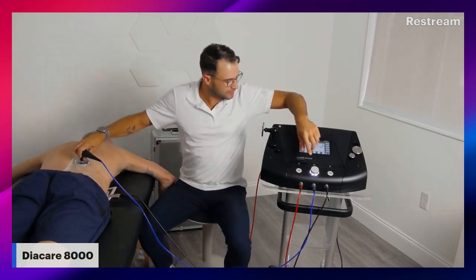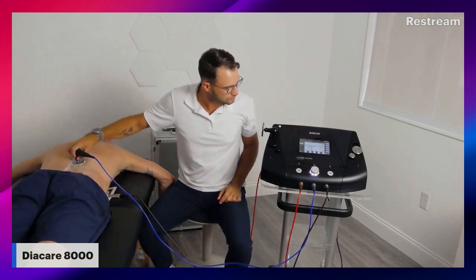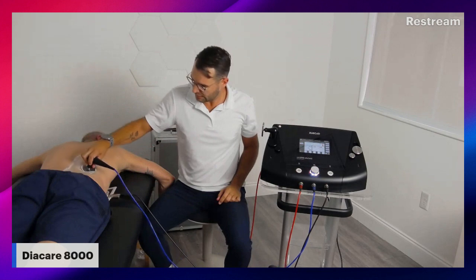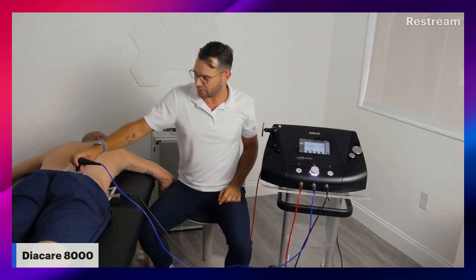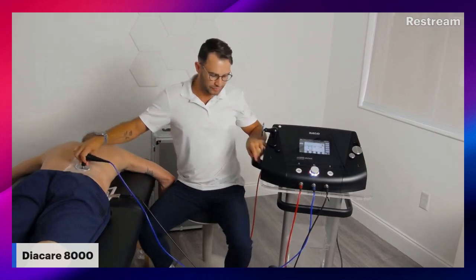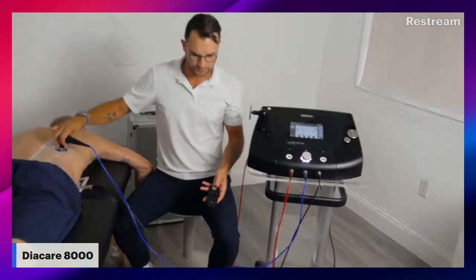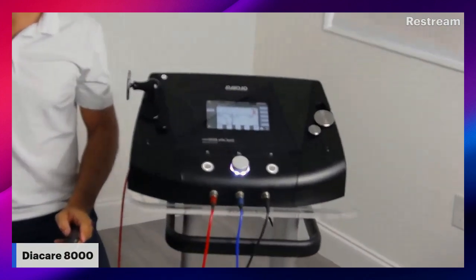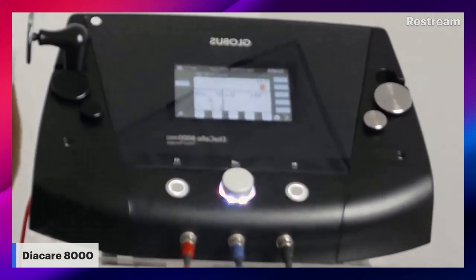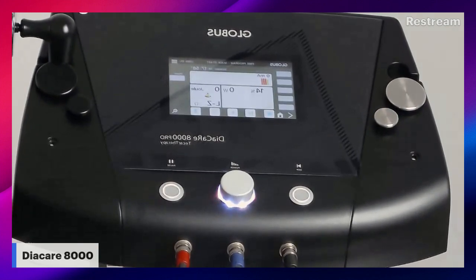So same way, we can see how much heat we're generating. And we're getting all the live stats directly on the machine here. I'll give you a little bit better of a look at the screen as we're finishing up. And you can see the graphic here of what's going on.